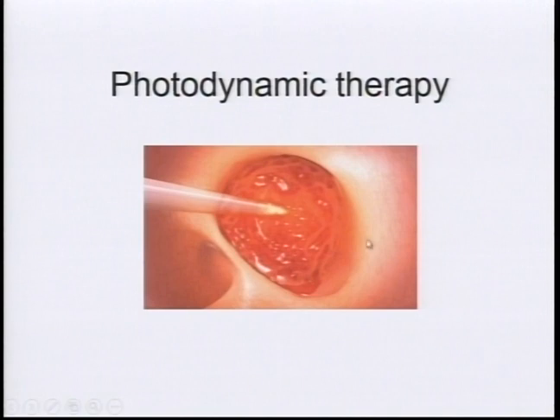Why would you do this as opposed to a more aggressive, multimodality bronchoscopy like the video I showed you earlier? This would be more for patients who couldn't tolerate a very low FiO2, so they need a lot of oxygen, and you really couldn't get that FiO2 down where you could use laser safely, or lesions that are in the upper lobes or very distally where it's not easy or convenient to get them out, or stuff that branches out and has diffuse involvement. So this light allows you to essentially induce tumor necrosis by shining it.